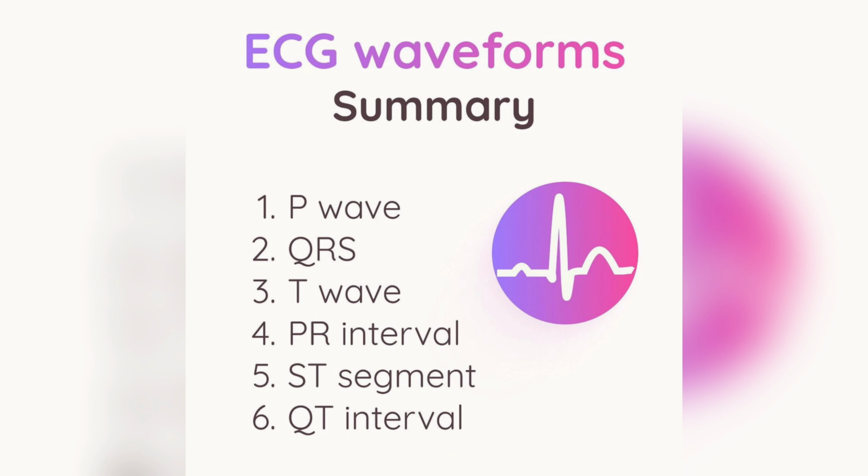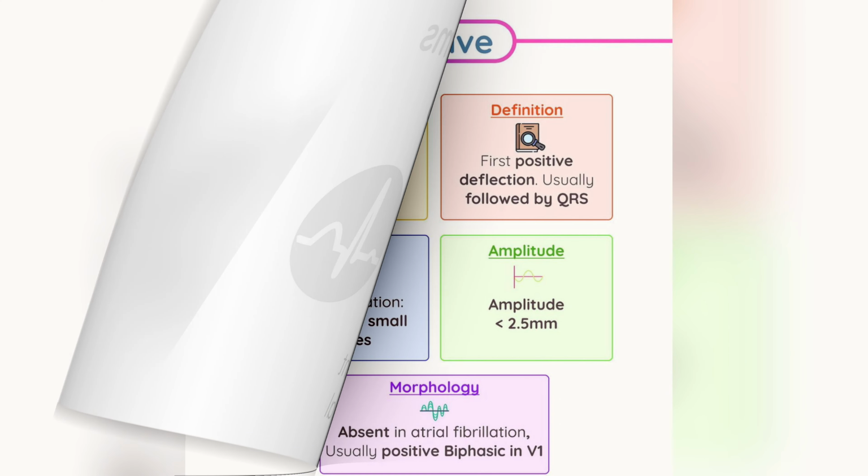Over the years, advancements in technology have made ECG machines more portable, accurate, and accessible. Today, the electrocardiograph is a vital tool in diagnosing and monitoring heart conditions. It's amazing how far we've come in understanding and caring for our hearts.